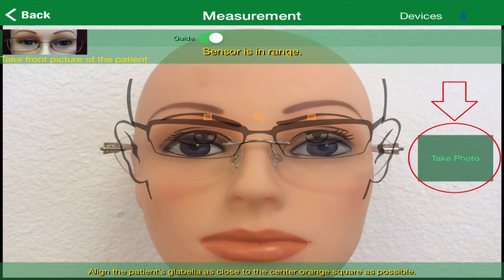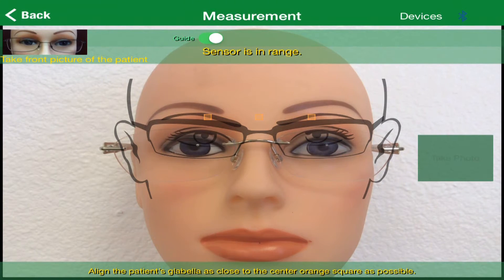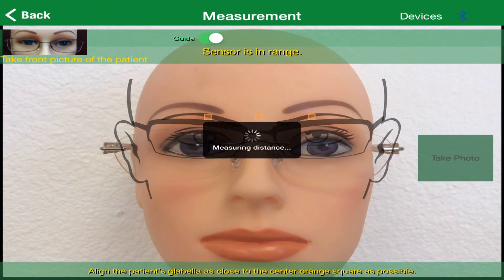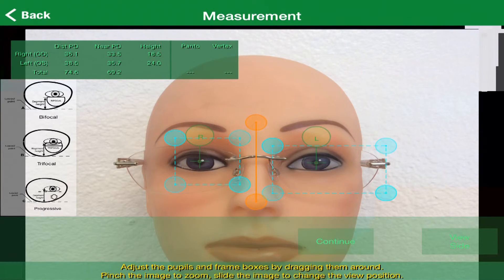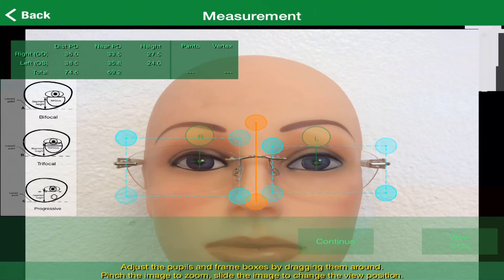A black box with the word Analyzing will appear on the screen while iCoach is making its calculations. Keep the patient in the same position for about three seconds to allow the device to collect data. Adjust the sides so the lines touch the innermost side of the frame's eye wire. This will ensure proper placement of the lenses in the patient's frame.